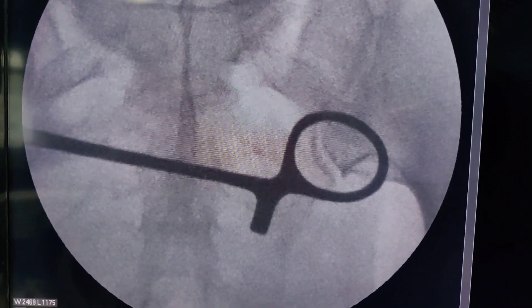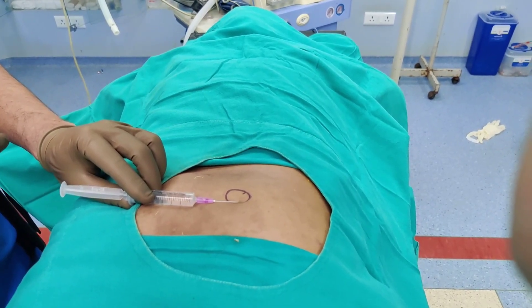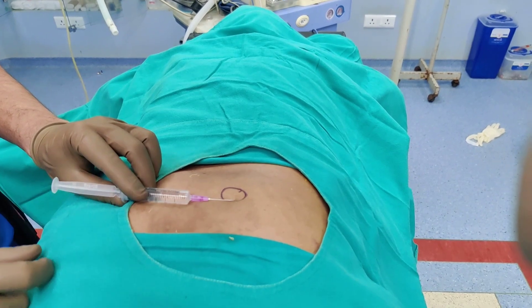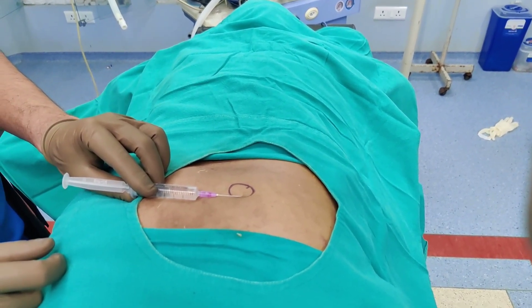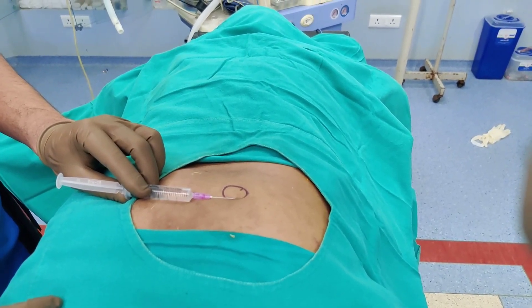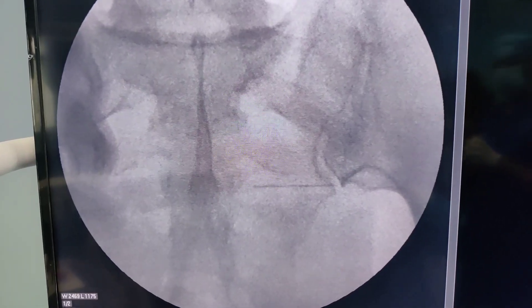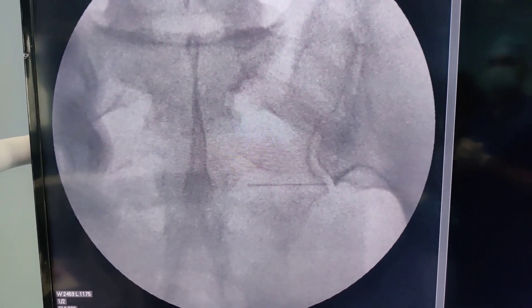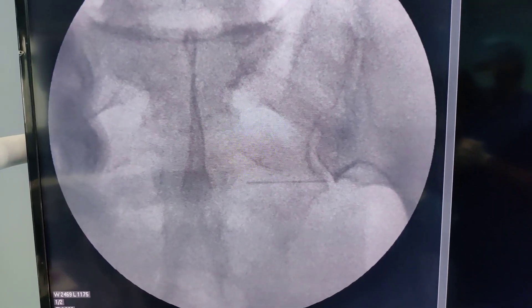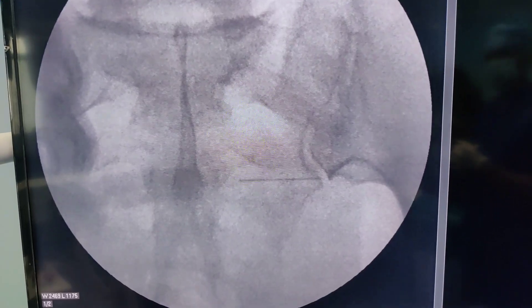I am taking a 5 ml syringe with local anesthetic and localizing the inferior aspect of the sacroiliac joint. On the image you can see that the needle is just on the medial aspect of the sacroiliac joint — that is a perfect position.